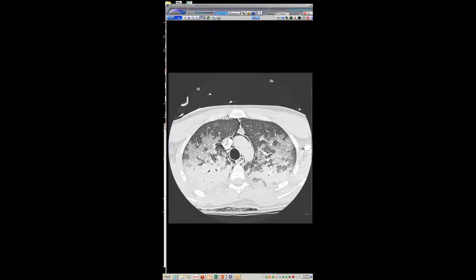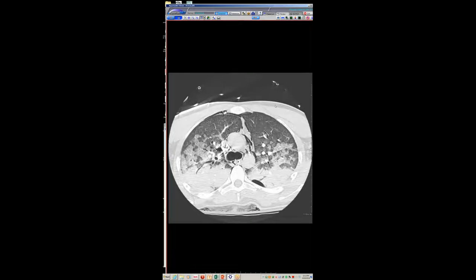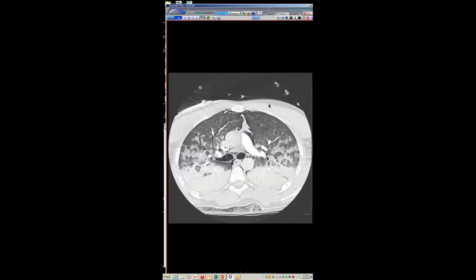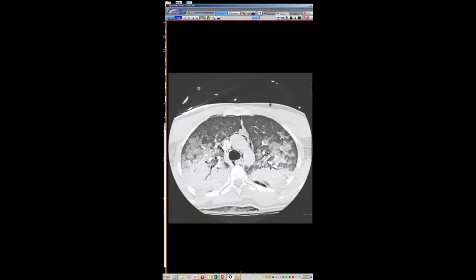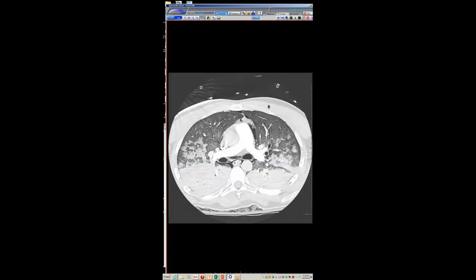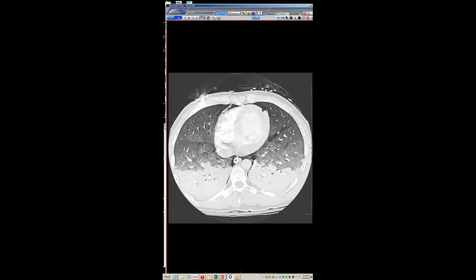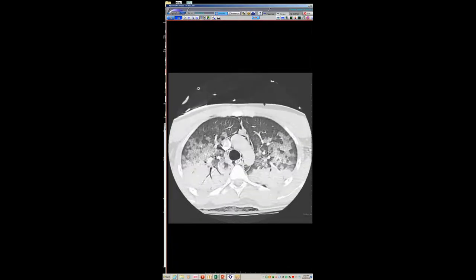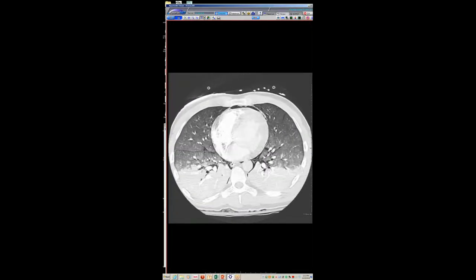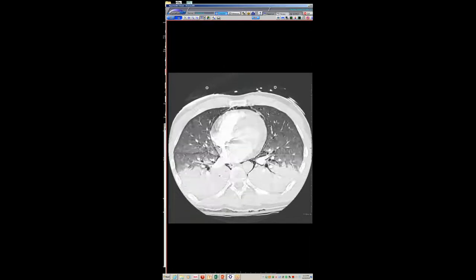In the parenchyma there's this very nice crazy paving pattern with more dependent consolidation and superimposed ground glass. The question to the group is, pathologically, what do you think this represents? The dependent stuff is going to be aspiration — he had a massive aspiration event at the time. But the other material: do you think this is pulmonary hemorrhage? Do you think it's sequelae of microscopic air embolism? Do you think it's acute lung injury such as diffuse alveolar damage?